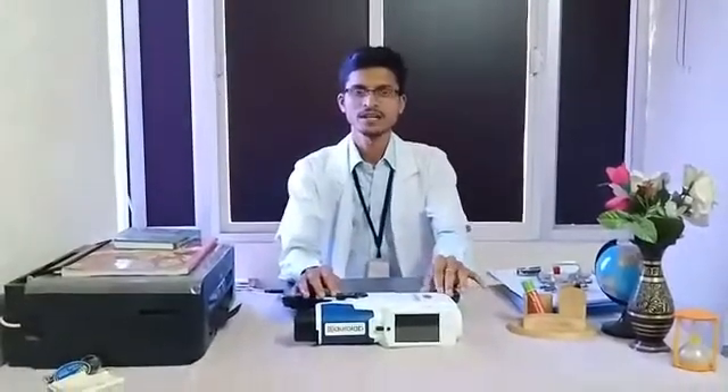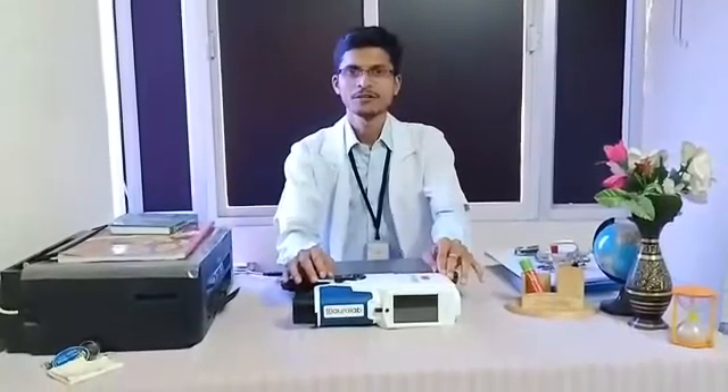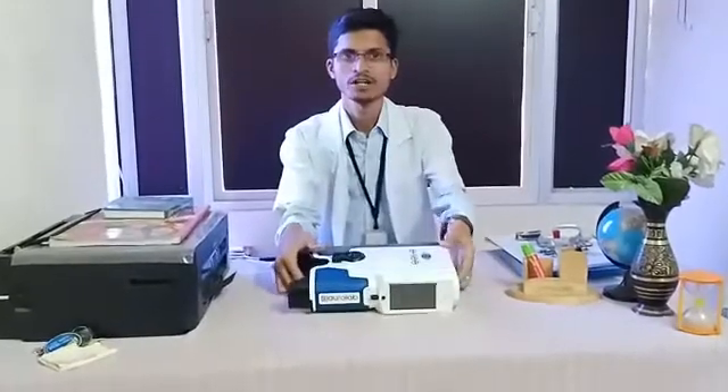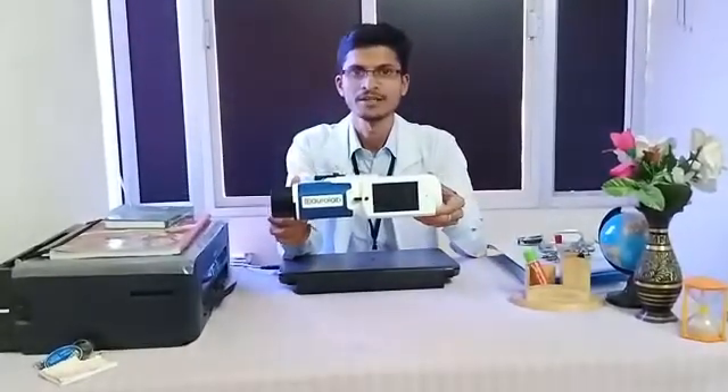Good morning all. I am Mr. Saranun, optometrist representing Achyuta Eye Care and Institute of Optometry. I first of all like to thank Auralab for giving me an opportunity to share feedback about this wonderful instrument — the Auralab handheld autorefractor.